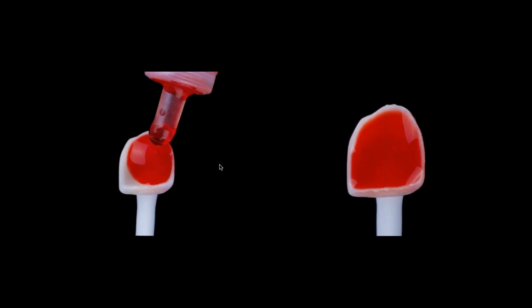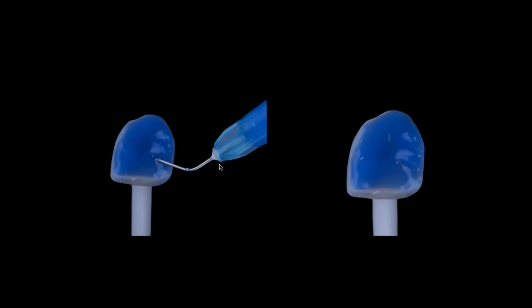You want to make sure that you have that complete intaglio surface covered by the hydrofluoric acid etching, but you place it in a way that the acid is not going over the proximal surfaces or the facial, so you don't lose that final glaze or polished surface, okay? Then after washing and drying, ultrasonic cleaning with alcohol is always a great way. Also, another possibility would be application of a phosphoric acid. As much of the literature shows, for lithium disilicate ceramics, this technique is beneficial to remove any excess.